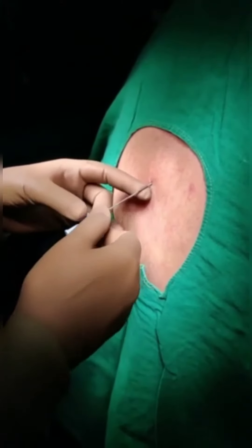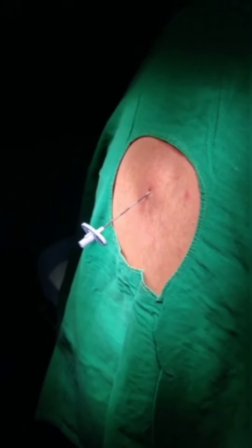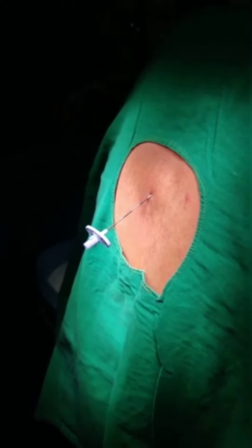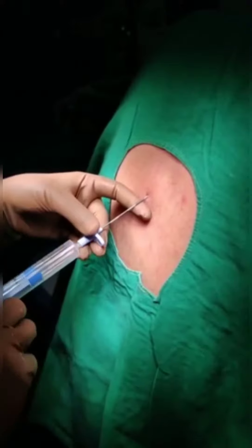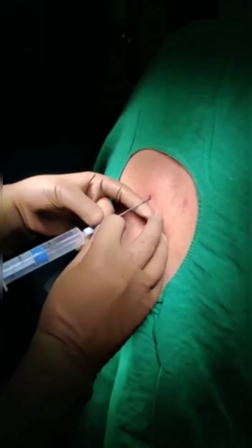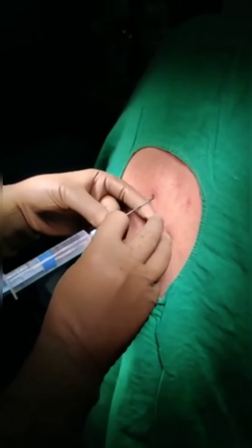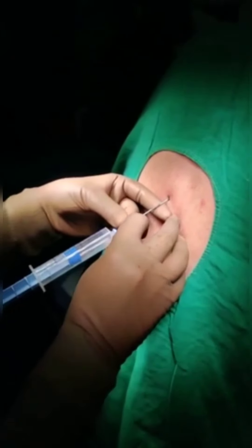Feel the upper border of the lower vertebra and just above it introduce the 16 gauge Tuohy needle in the midline into the skin and subcutaneous tissue. As the Tuohy needle is advanced further, it pierces the supraspinous and interspinous ligament. Remove the stylet from the needle — this prevents the needle tip from getting blocked by the tissues. Now attach the loss of resistance syringe with not more than 3-5 ml of either air or saline. Advance the entire assembly of the Tuohy needle and the loss of resistance syringe into the back not more than 2-3 mm at a time. Each time, check for resistance by gently pushing the plunger in the syringe. It should bounce back because of the resistance of the tissues.